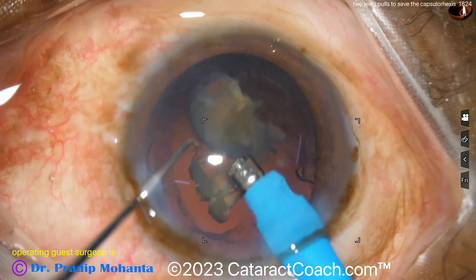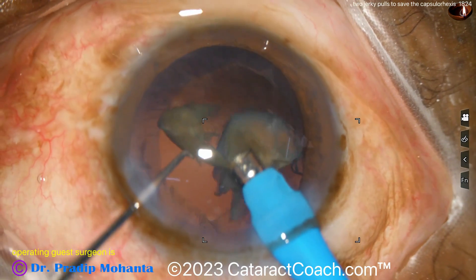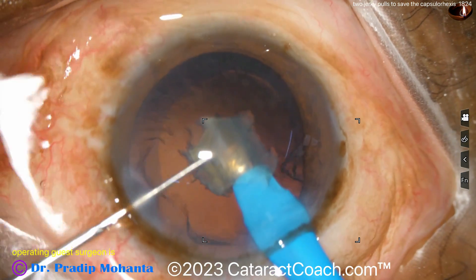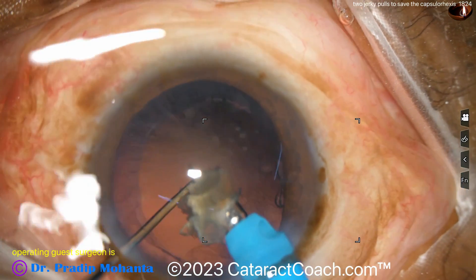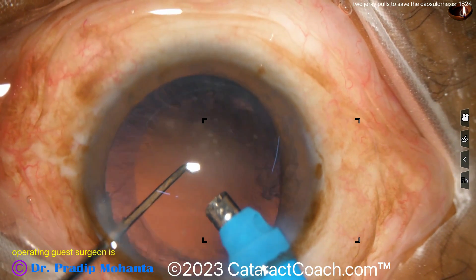Two jerky pulls — we're all going to run into a situation where we need to rescue a run-out rhexis, and this technique really works quite well. The end of the case looks fantastic. Notice how he slowed down — smart move — just to make sure you have good chamber stability and you're not going to let that posterior capsule come up.